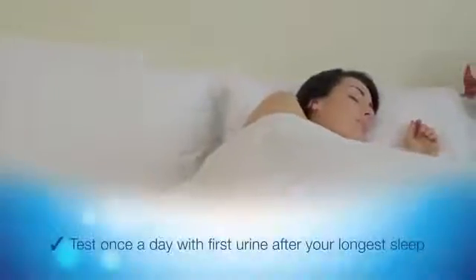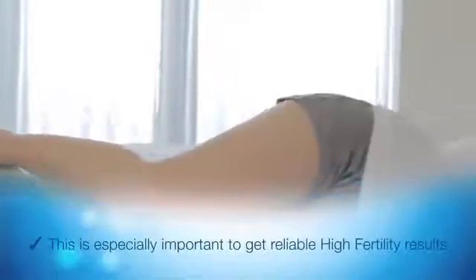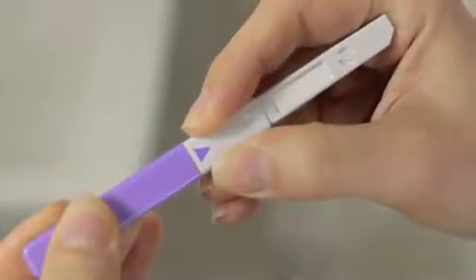Test once a day with the first urine after your longest sleep, as this is when the hormones are most concentrated. This is especially important to get reliable high fertility results. Don't test more than once a day before you see high fertility. Only remove the foil wrapper when you're ready to test.